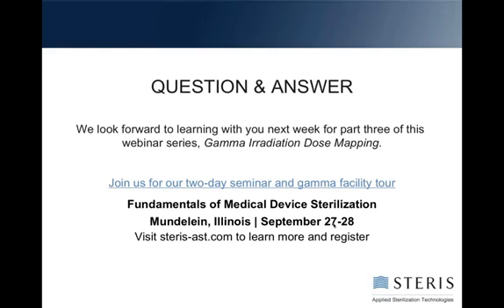And if you think about it, you're getting a very generous dose if your bioburden is very, very low with a VD max. But by the time you start getting closer and closer to the cutoff, you have to match what's in method 1, and you can't get more dose than you would get to method 1.